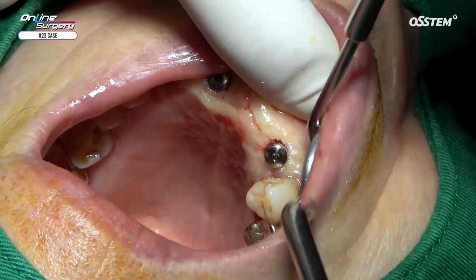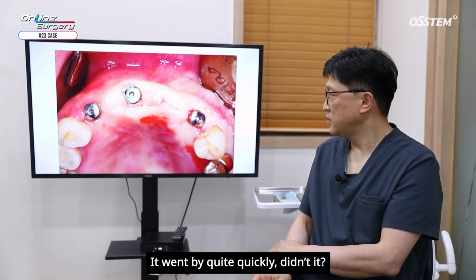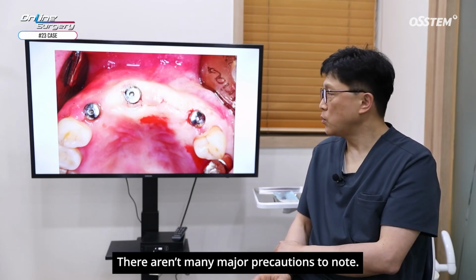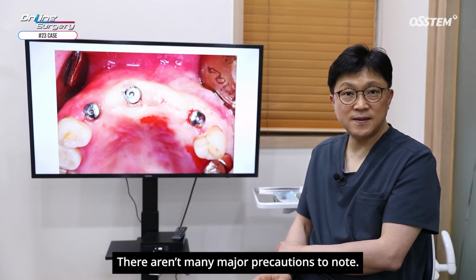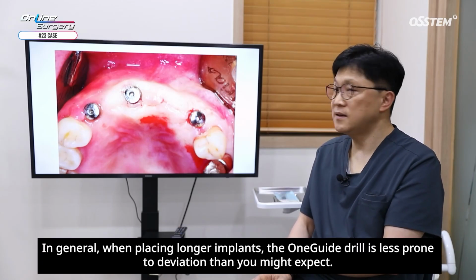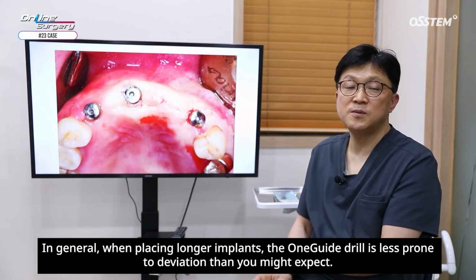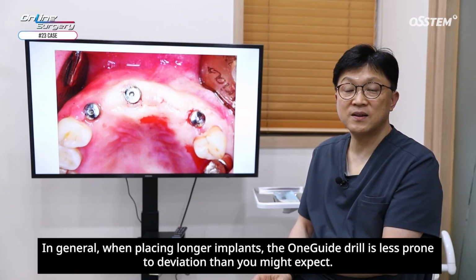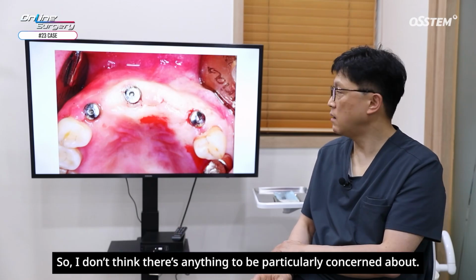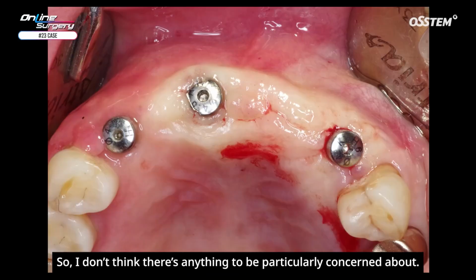I hope you found that helpful. It went by quite quickly, didn't it? There aren't many major precautions to note. In general, when placing longer implants, the one-guide drill is less prone to deviation than you might expect. So I don't think there's anything to be particularly concerned about.